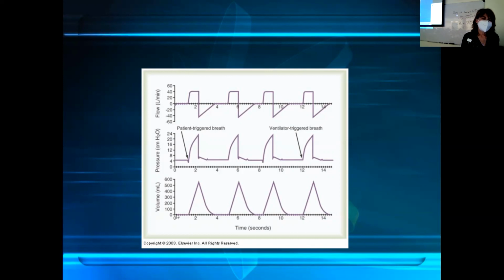All right, and then for volume, volume goes into the lungs and then volume comes back out of the lungs. So this is inspiration and this is exhalation.